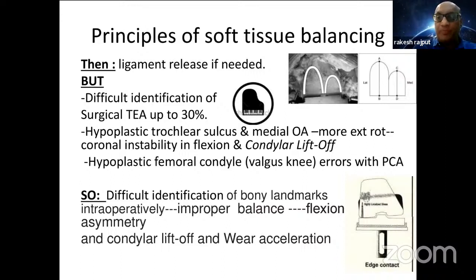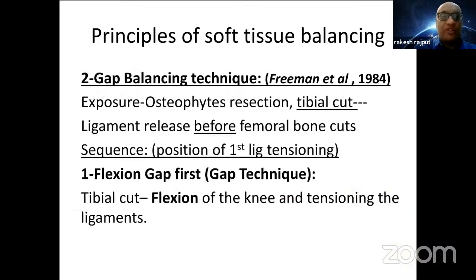Next comes the cut tibia. That is why Rajeev was telling you to do the tibia first, take your time, cut it really well, so that if you are erring in all the other three types of axes, you can still fall back on the tibia. So that's what we mean by a measured resection. So you do your cuts and then you look at the gaps, how you're creating an extension gap first, and then go on to the flexion gap.